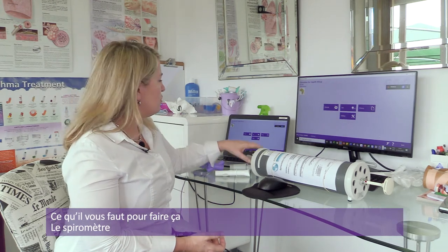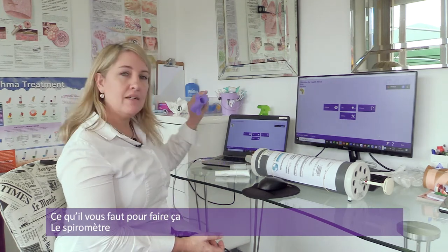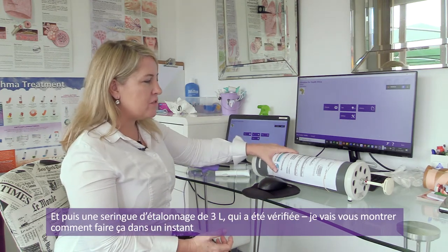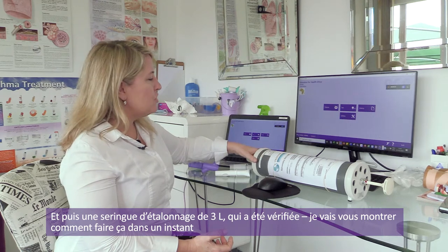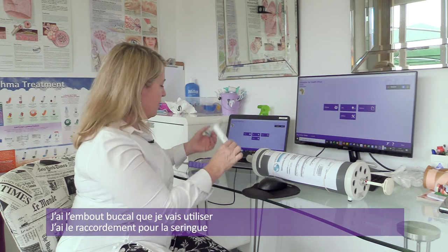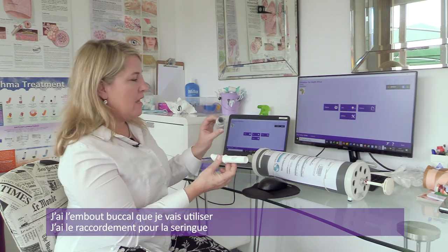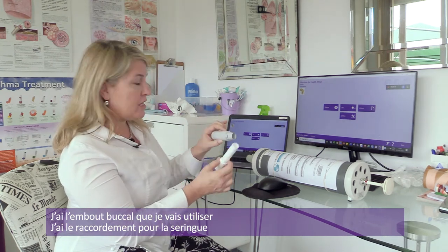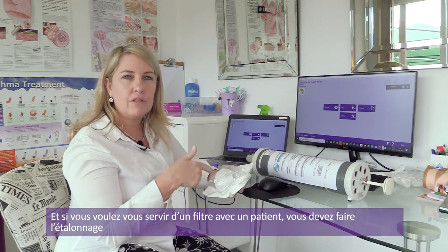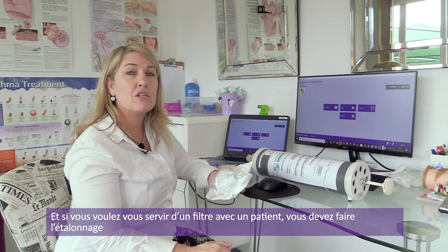To start off with, you need your spirometer, and then you need your various pieces. You need a three-liter calibration syringe, which is verified. I have the mouthpiece that I'm going to use, and I have my syringe connector. And then if you are going to use a filter on a patient, you would connect your filter when you're actually doing the calibration check.